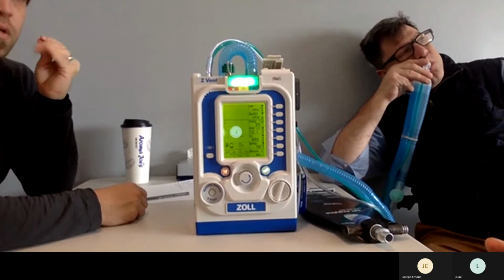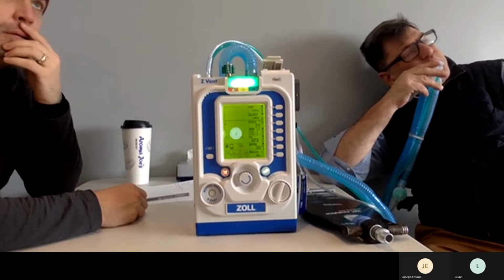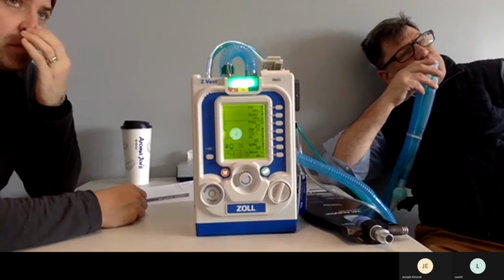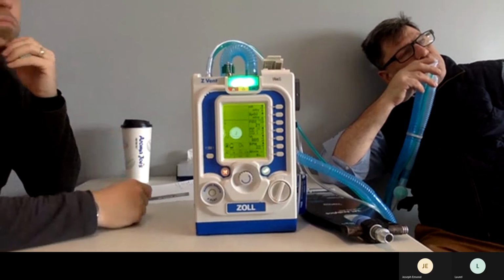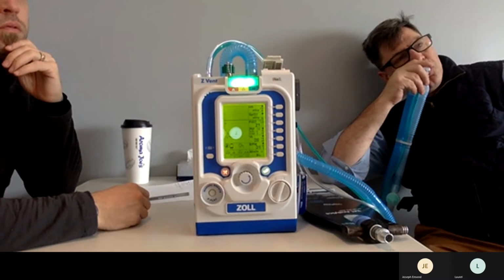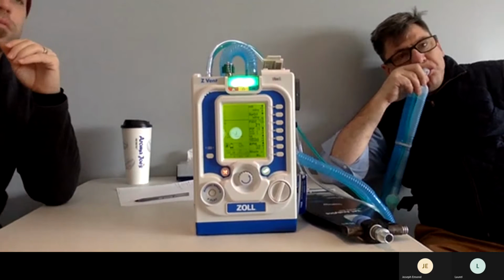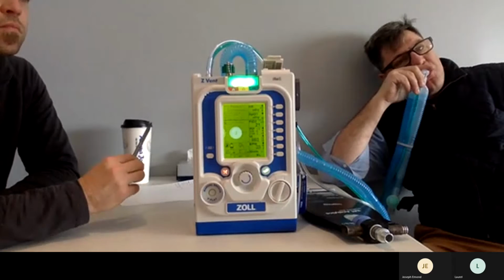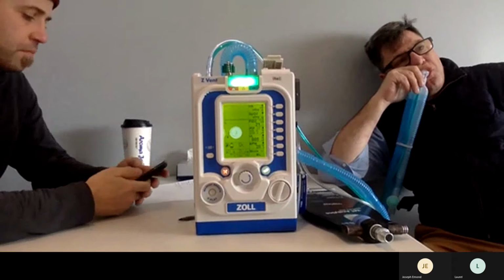That's right. The thing I like about BiPAP is being on CPAP at night, I do better on BiPAP. It's more comfortable. You're not breathing in and out against the same pressure. You get more of a blast pulling in. That's why our CHF patients did so good with BVMs and demand valves, because you got that and then a little bit. But we lost lung recruitment in between, right? But that increased inspiratory pressure is easier to breathe and helps clear lungs.